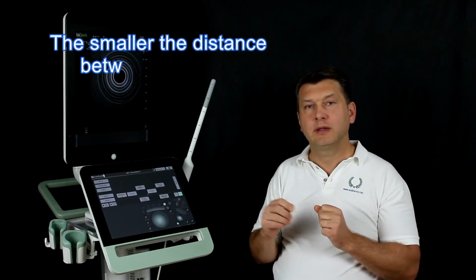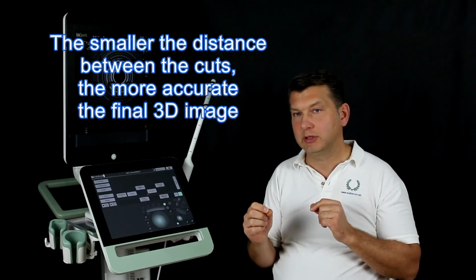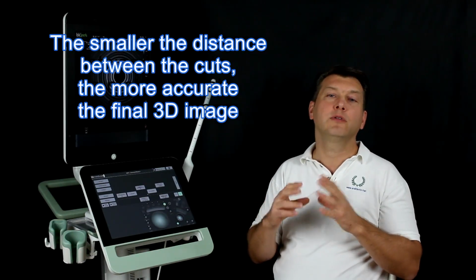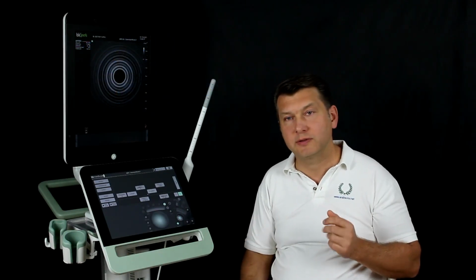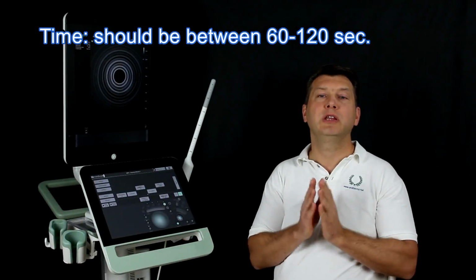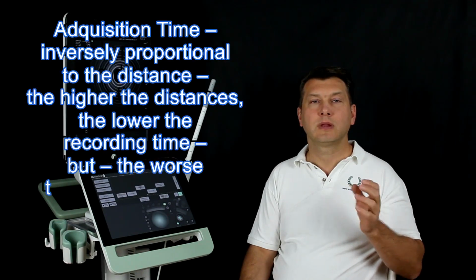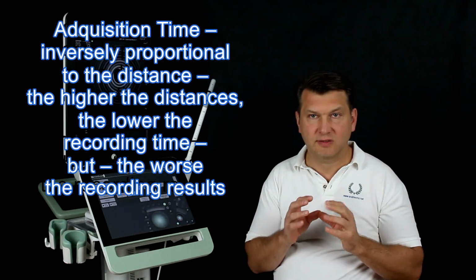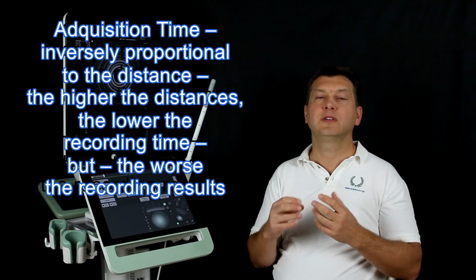The distance. The distance between the individual cuts should be chosen as low as possible. This provides more information in the final image. The quality of the 3D box is increasing. The time. It should be between 60 and 120 seconds. If the image distances and the resolution are reduced, the recording time increases automatically.